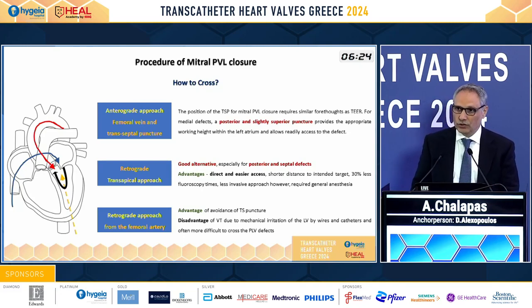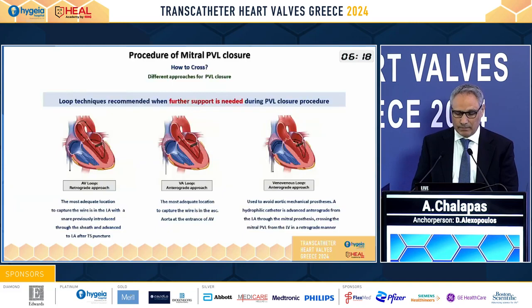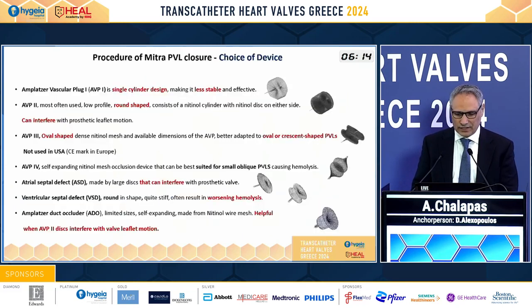We no longer use the retrograde approach through the femoral artery due to the electrical and hemodynamic instability. Of course, when further support is needed, we can use different loop techniques.